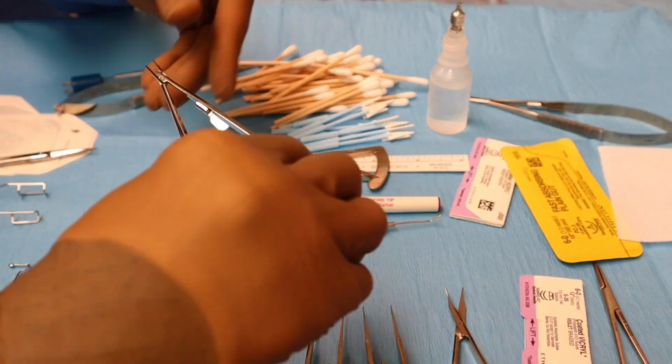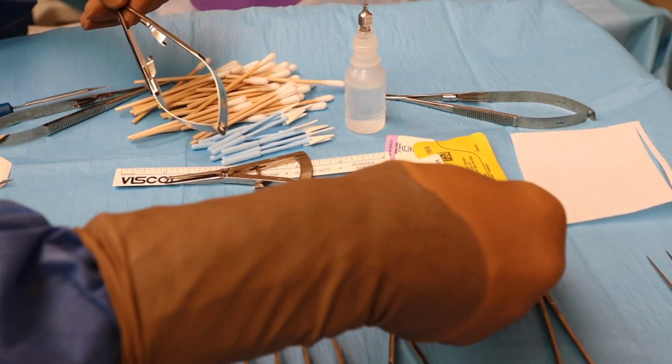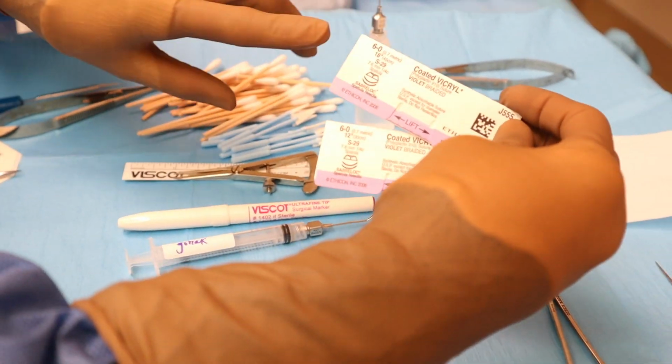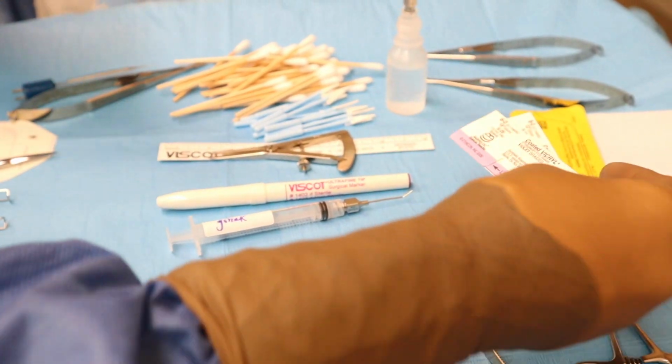That's the needle driver, which is what we use to attach to the stitch, to the needle and stitch. And that's my main stitch that I use when I'm doing strabismus surgery, is that 6/0 Vicryl. Comes on 2 different lengths. It can come on basically a 12-inch and an 18-inch, which is good.